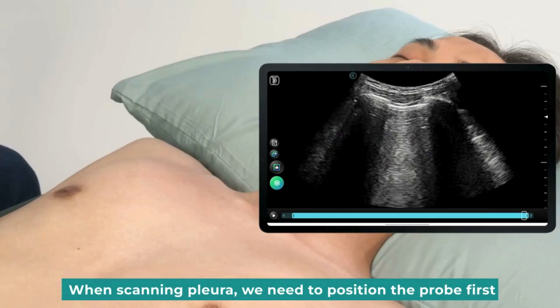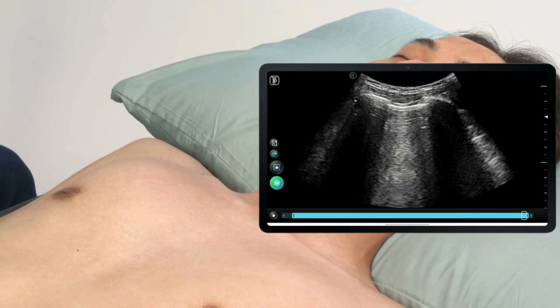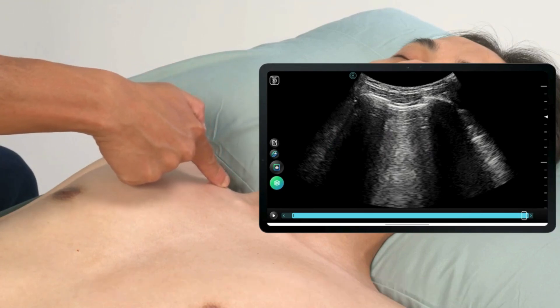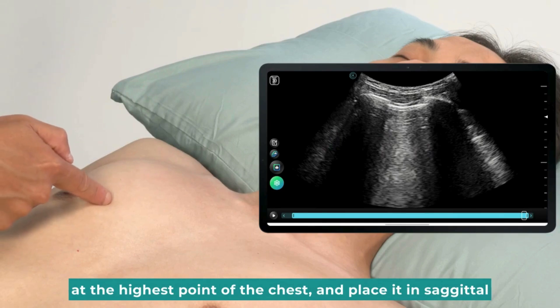When scanning pleura, we need to position the probe first. I would place the probe at the center of the clavicle, at the highest point of the chest, and place it in sagittal.